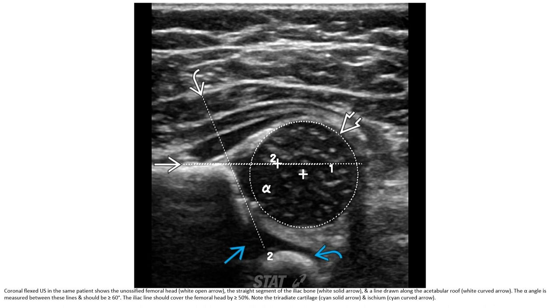This is the coronal flexion ultrasound image in the same patient. We can identify the ossified femoral head, the straight segment of the iliac bone, and a line drawn along the acetabular roof. The alpha angle is measured between these lines and should be more than 60 degrees. The bony acetabular roof should cover the femoral head by more than 50 percent.